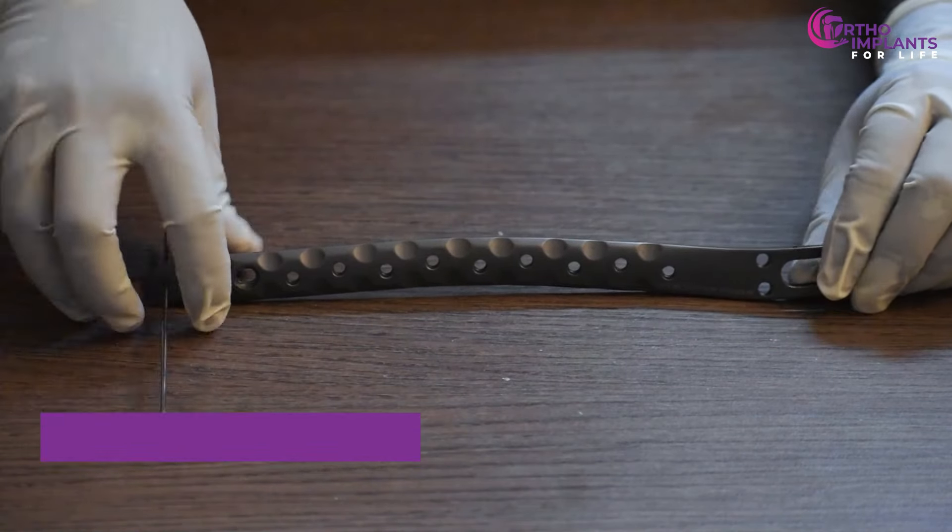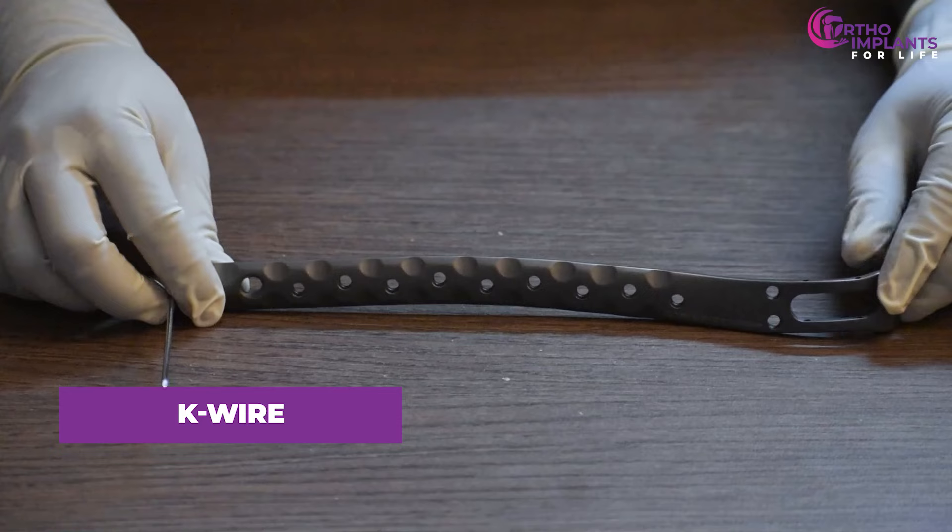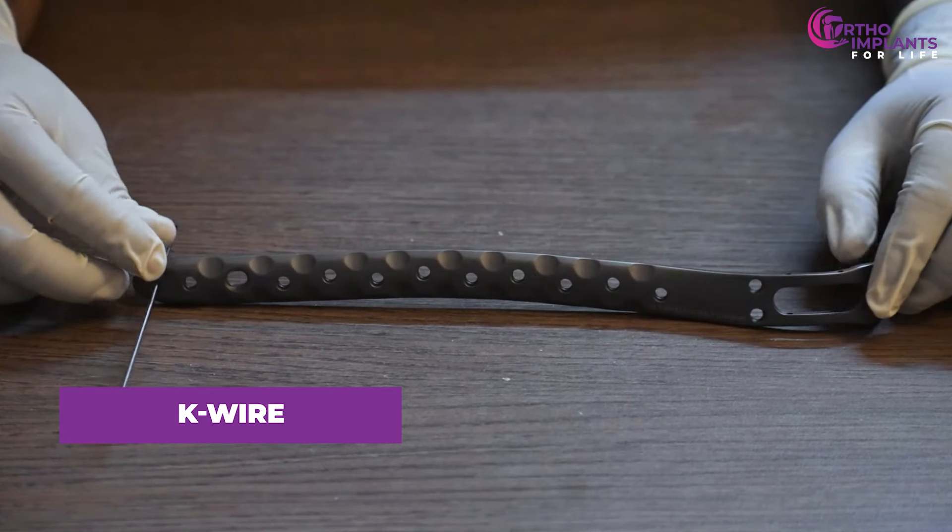After that, we will have to fix the blade in the bone using a k-wire here at the distal end of the plate.